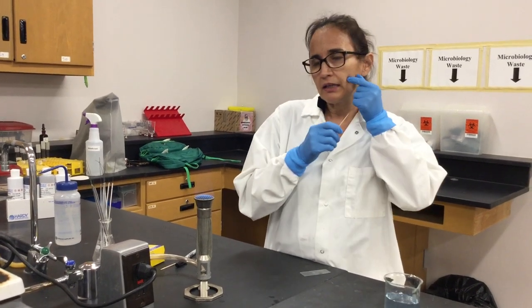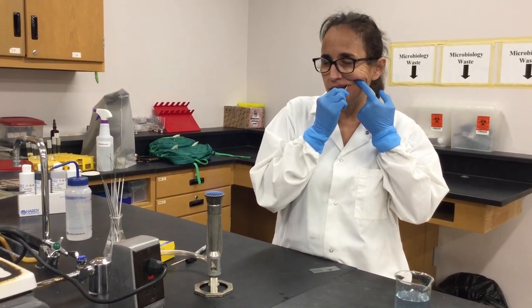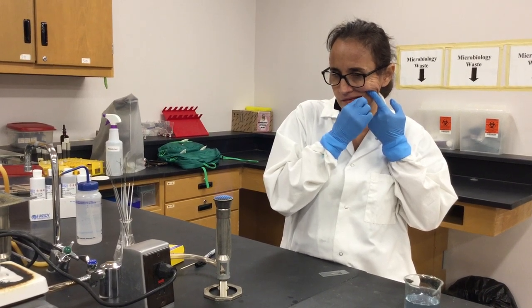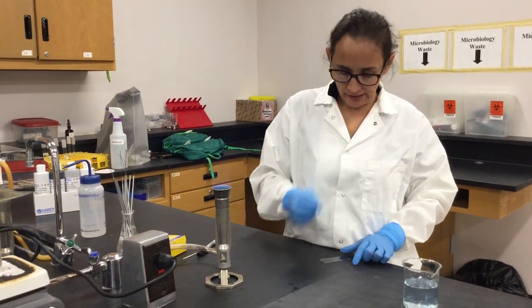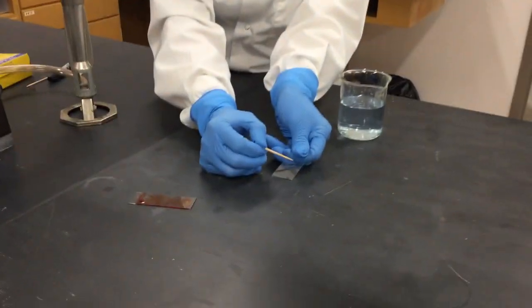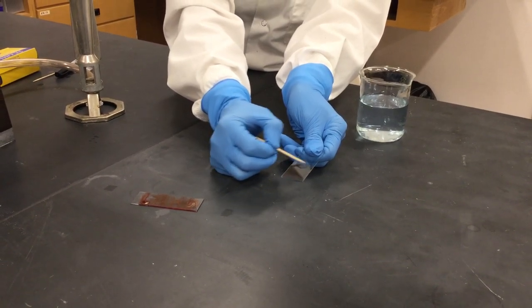So you will retract your cheek a little bit to the side. Introduce your toothpick, find the gum line, the area between the tooth and the gum, scrape really well, and then mix it here with your water in a circular motion.